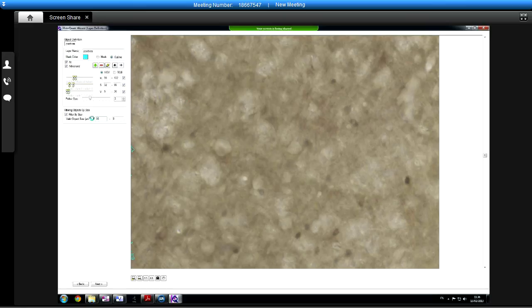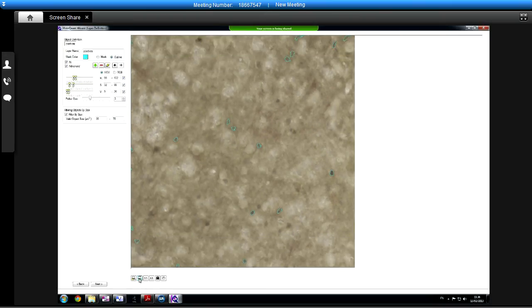And now what you see is it's only showing me the ones that both fulfill the colour criteria and fulfill the size criteria that we've put in. So now we're getting closer, I think. Might not be completely there yet, but we're getting closer to, in this particular area, a representative count, aren't we? So would you say true, true, true, all these, what about these ones up here? Probably? Probably, yeah. Yeah, okay.